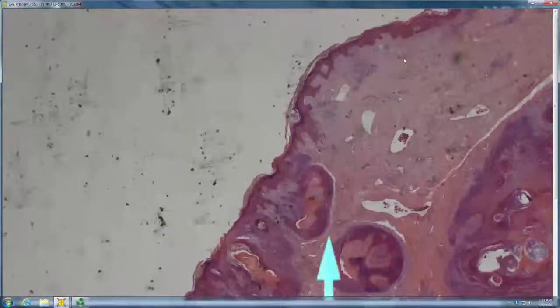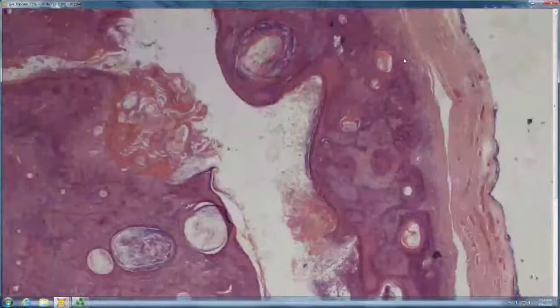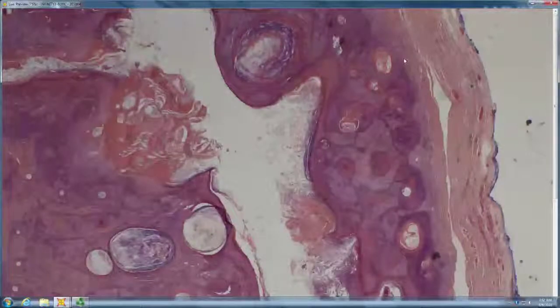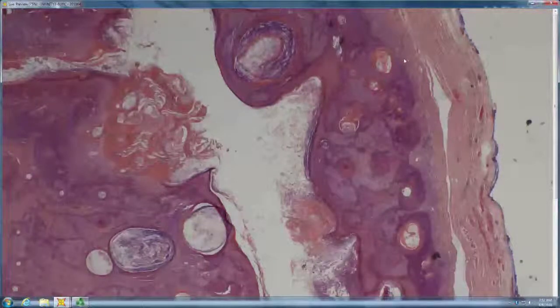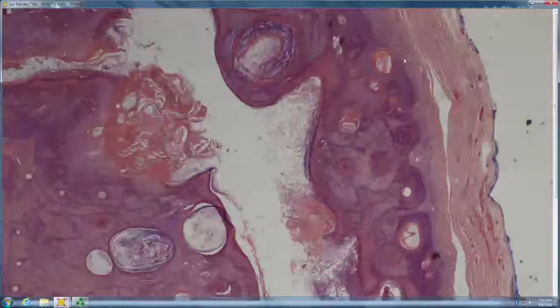Now, up above, you have exactly the same tumor, but it connects to the epidermis. That's an epidermal panfolliculoma. So epidermal panfolliculoma, cystic panfolliculoma, just like the name implies, it is panfollicular differentiation. So there are areas that look tricholemmal, there are areas that look like pilomatricoma, there are areas with red trichohyalin granules, so it's all portions of the hair follicle in a panfolliculoma.